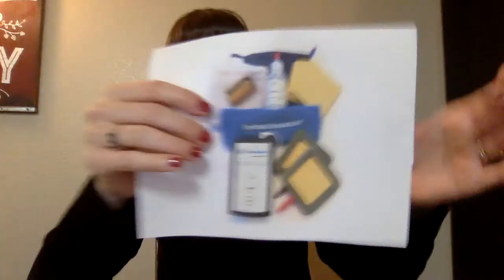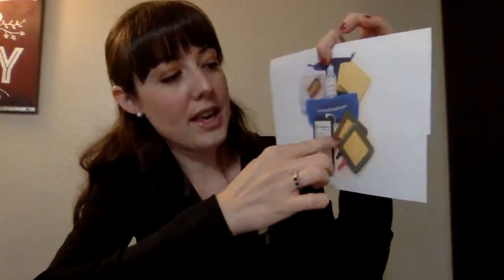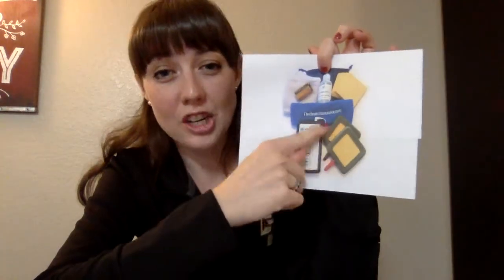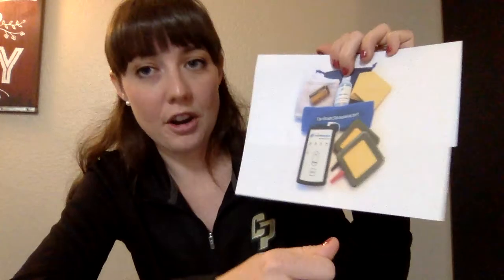So when you're setting up your treatment, you want to make sure that the battery is installed into the main port, into this. And you also want to make sure that this white cable is plugged in on one end to your port box, and the other end is going to go to these 2 electrodes. Now this part is kind of tricky and very important.